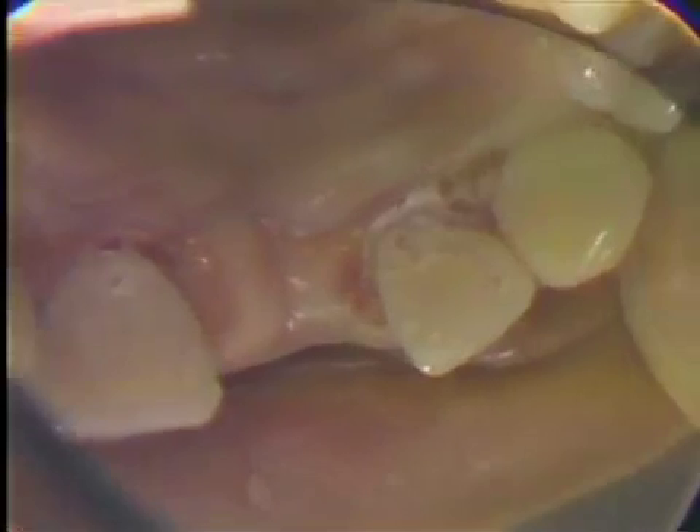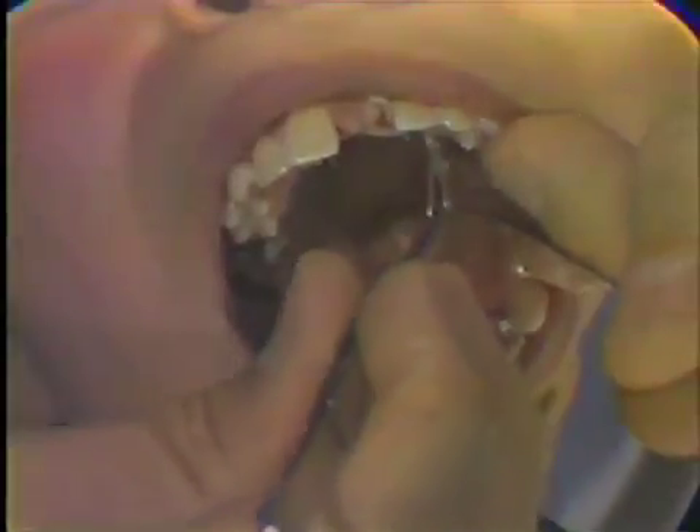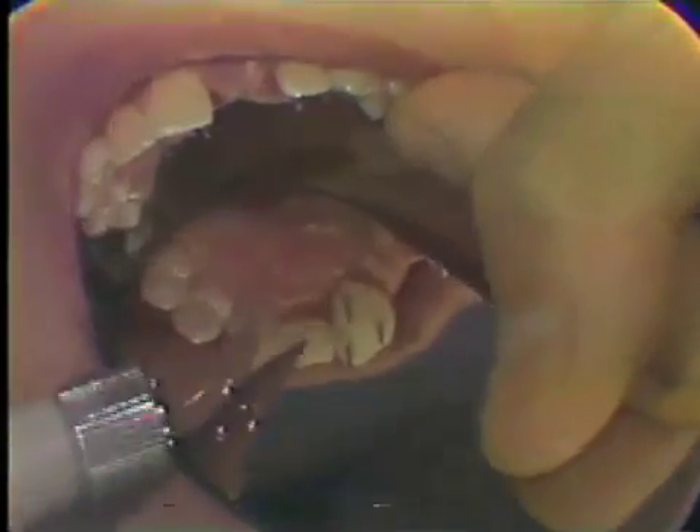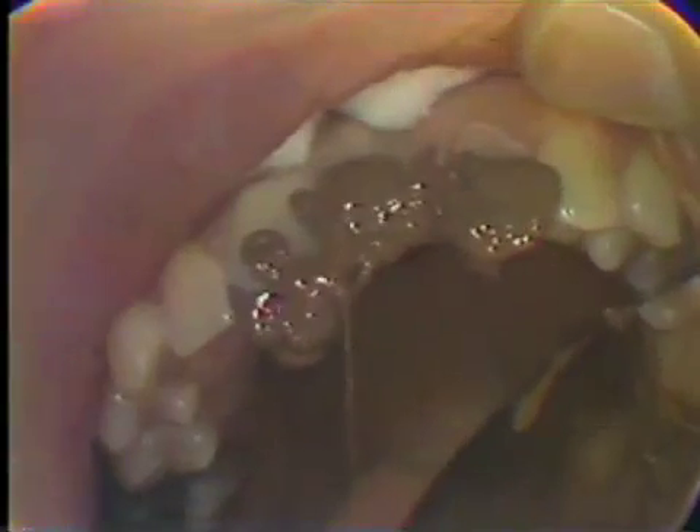Now that everything is finished, we are ready to take our rubber base impression. We'll remove the string pack that has been left in for five minutes. This should be done very carefully because if this is jerked out, bleeding will start. Then the rubber is injected very carefully around the cervical of the preparation, around the pins, being careful not to dislodge them. Once this preparation has been injected, we go over to the lateral — the cervical, then around the pins, up on the incisal edge and across the ridge — making sure that we have enough light-bodied rubber base material.